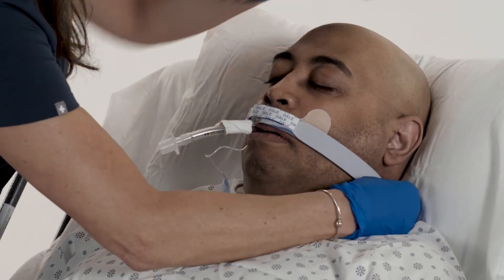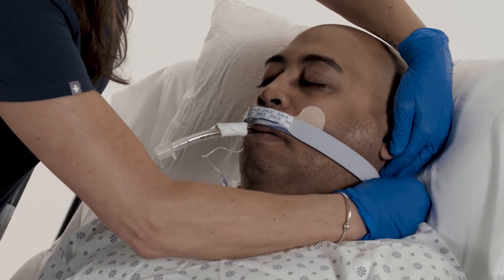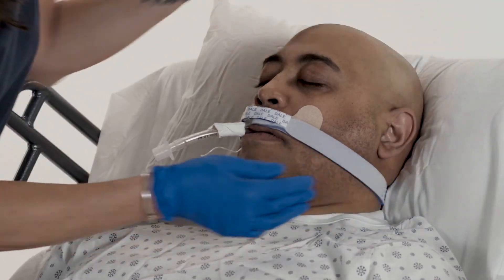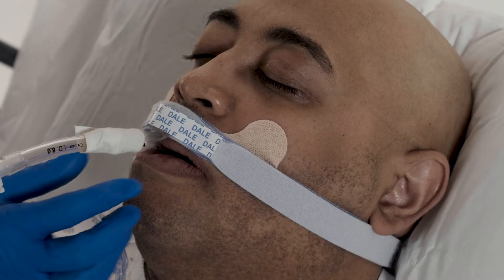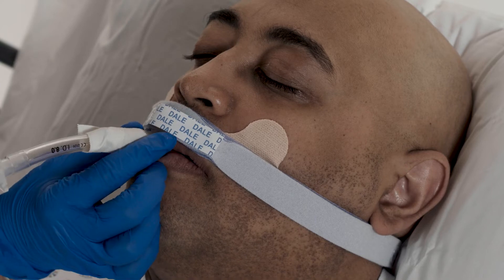Adjust the fastener tabs on the neckband for a snug fit as necessary. To reposition the tube in the patient's mouth, hold the taped channel with one hand.